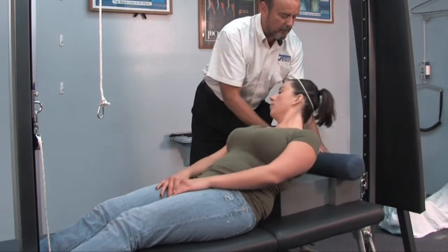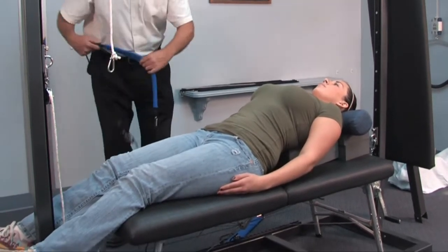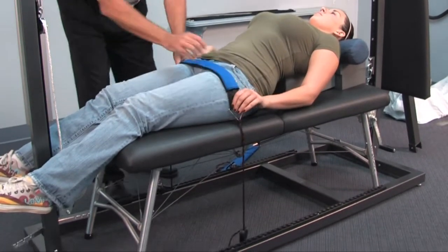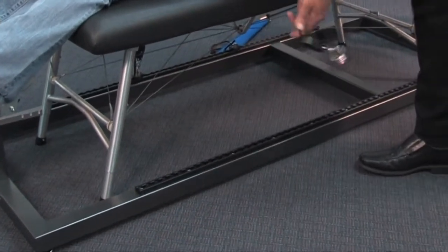We'll have Amanda lie down. First we're going to place the straps across the anterior thighs and tighten them down. This placement ensures that when we apply the traction, we get the nice flexion to the pelvis.